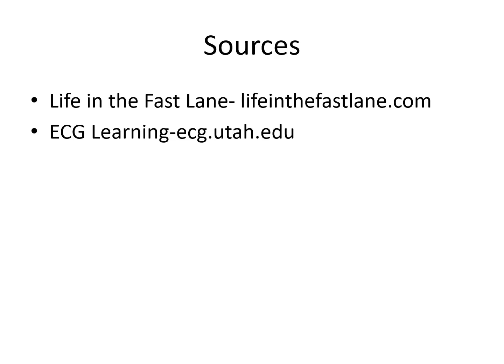Most of the ECGs in the course are my own or those of my colleagues at Trenton or Belleville hospitals. However, a few I have taken from the internet, namely from these two open source websites, Life in the Fast Lane and ECG Learning, both of which are amazing open source ECG educational websites.